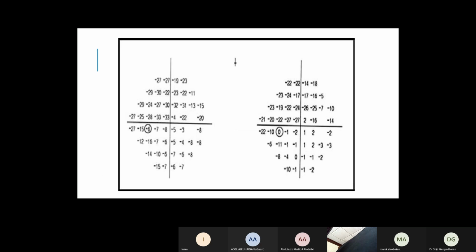Is that clear? Okay. So imagine that we have a test for students. The students did the test, and most of them failed. This is the same as the total deviation. If we have a lot of dark spots, that means most of them are failing. We want to know which ones really did not study for the exam. So we put a curve for the students. With this curve, some of them will pass, and some of them will still fail after the curve. We want to see this group in the pattern deviation.